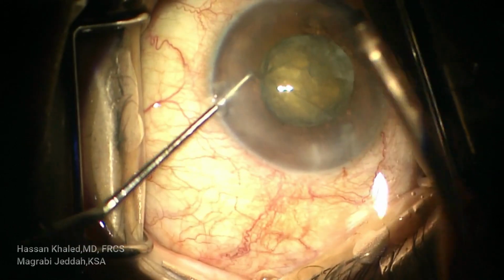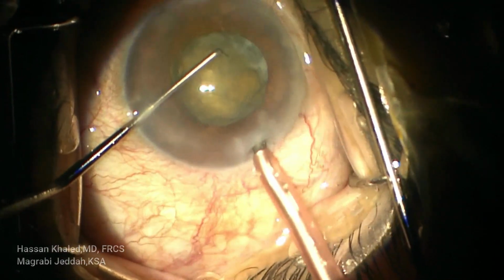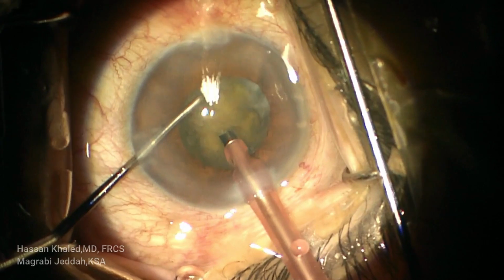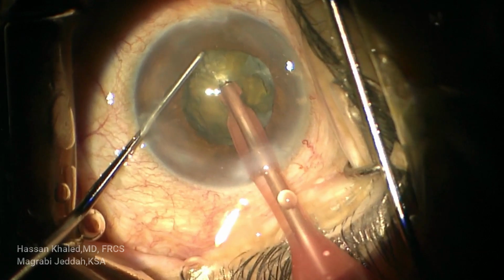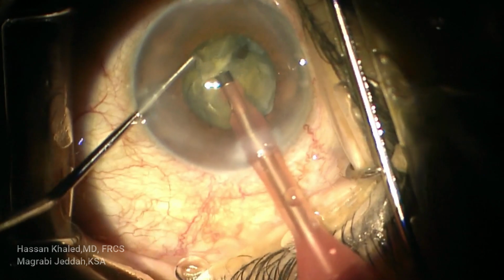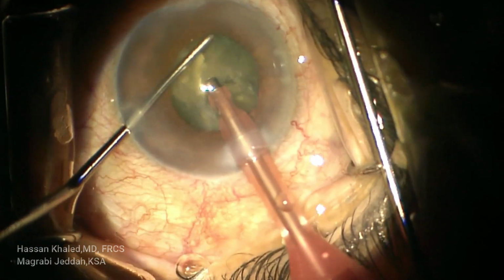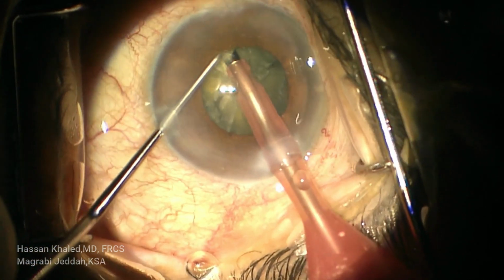Now using a sharp pointed chopper for the vertical chop technique, with bevel up or bevel down, shaping the cortex, you can chop this nucleus into halves. After chopping this nucleus into halves, you can chop each half into smaller pieces, as you see. By the end you can see the nucleus is chopped into smaller pieces, like pieces of pie.